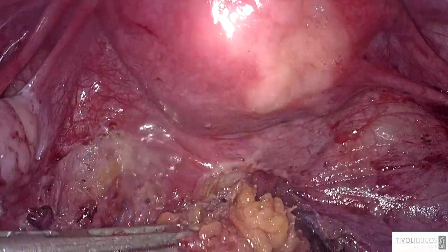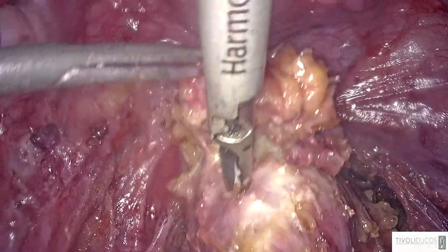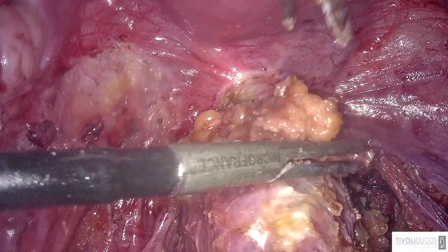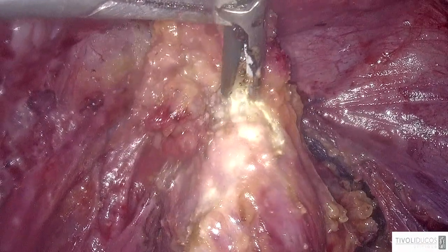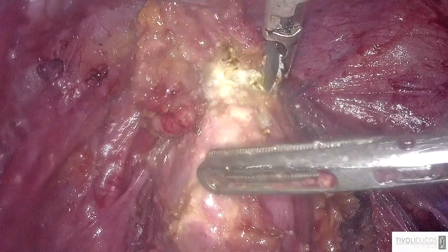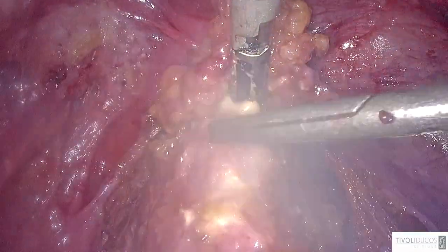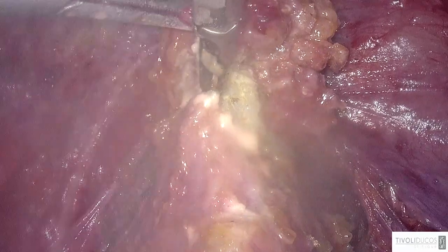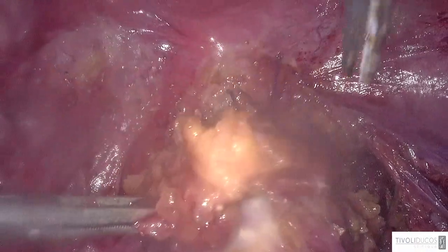Clean. Okay. So you see, I continue to follow the rectal wall. You see, here is the probe. And you see that once we remove this, the rectal wall becomes soft. So I said that the risk of fistula is very likely similar between disc excision and segmental resection, but I think that the patients with a low nodule, the patients with disc excision are more likely to have a normal bowel movement than the patients with low colorectal resection. And I'm sure, because we have just finished a study comparing for the low rectum.